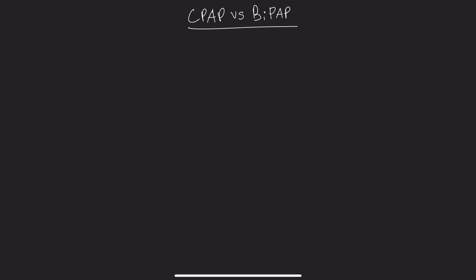Alright guys, welcome back. Today we'll cover CPAP versus BiPAP, specifically their uses in the critical care setting. So we'll go ahead and get right into it here, starting with CPAP. CPAP stands for Continuous Positive Airway Pressure.